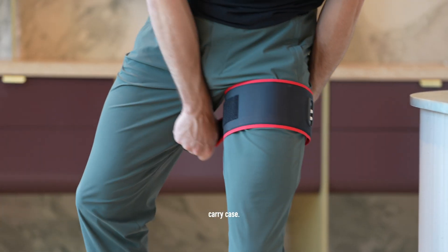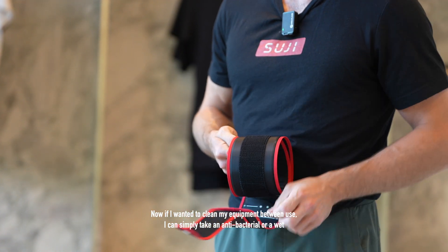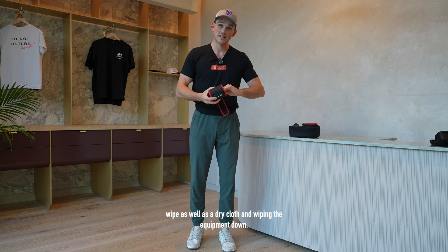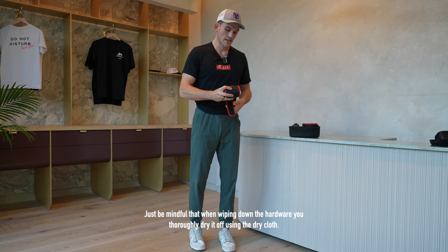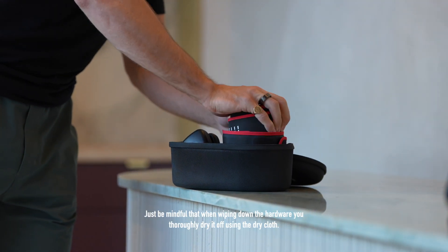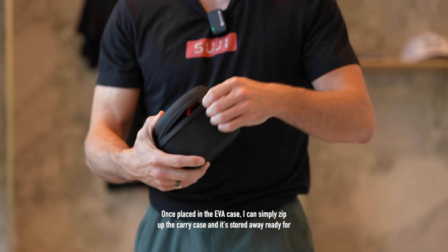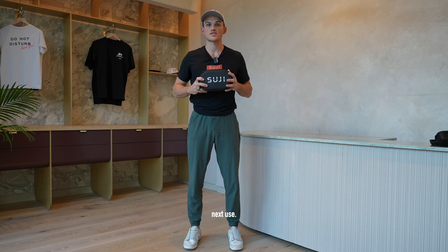Now if I want to clean my equipment between use, I can simply take an antibacterial or wet wipe as well as a dry cloth and wipe the equipment down. Just be mindful that when wiping down the hardware, you thoroughly dry it off using the dry cloth. Once placed in the EVA case, you can simply zip up the carry case and it's stored away ready for next use.